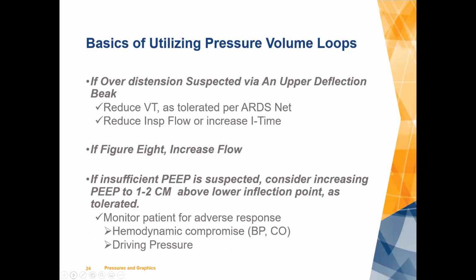And you're looking at various parameters. Well, how much? You're looking at oxygenation. You're also looking at hemodynamics, because at some point you're going to increase your PEEP so much it can compromise the patient from a hemodynamic perspective, as I have in this slide here, mainly because you're impeding venous return, but also because the lungs are really getting quite inflated at baseline and they're tamponading, they're squeezing the heart, if you will. And then again, if you're doing that, you're monitoring the patient for adverse responses. Again, hemodynamics and looking at your driving pressure as well.